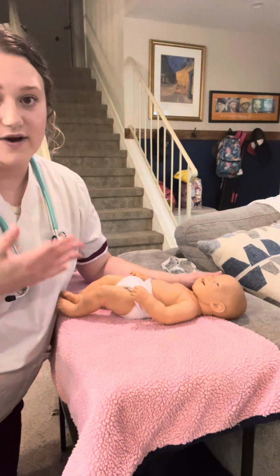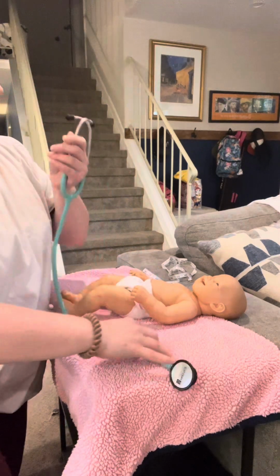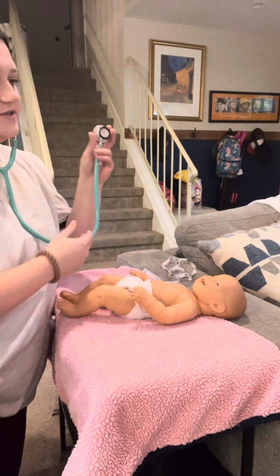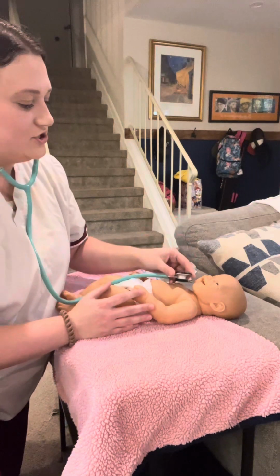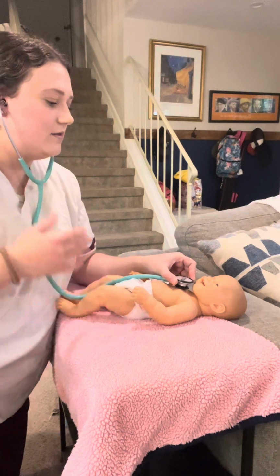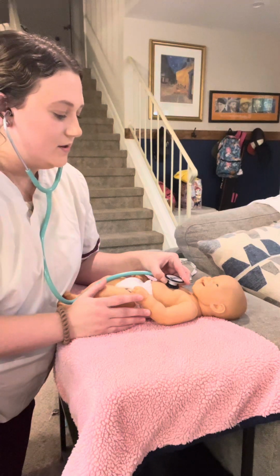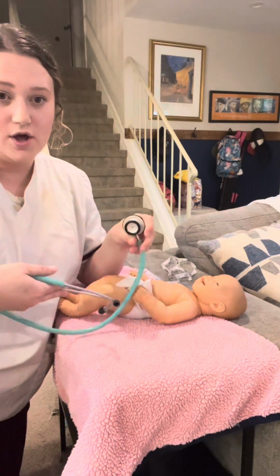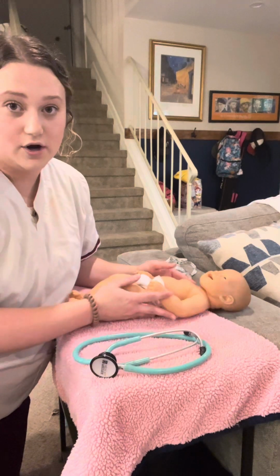And then I would go ahead and do some vital signs. So I would do temperature, pulse, and respirations. And I would listen for the full minute. And I would also listen to the baby's apical heart rate. But first I'd listen to respirations for a full minute, and then apically I would also listen for a full minute as well. Okay. And I'd also listen to see if I hear any murmurs or anything like that. All sounds good. And then we're gonna go ahead and start measuring our baby.